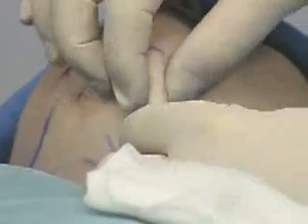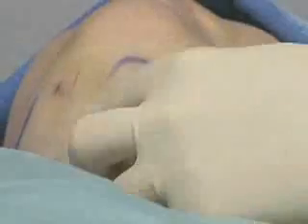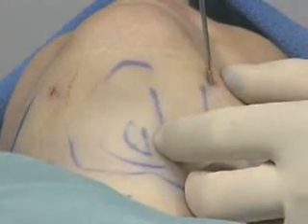It's very thin, whereas before it was real thick. We've really thinned it out quite a bit. We've given her a nice sharp angle beneath. It's still a little thick right there. I'm going to take a little more right there in that corner.